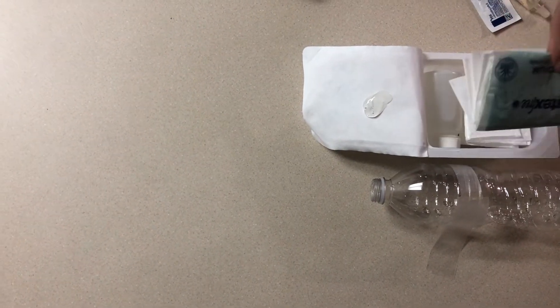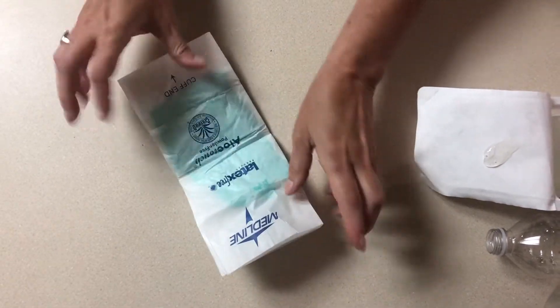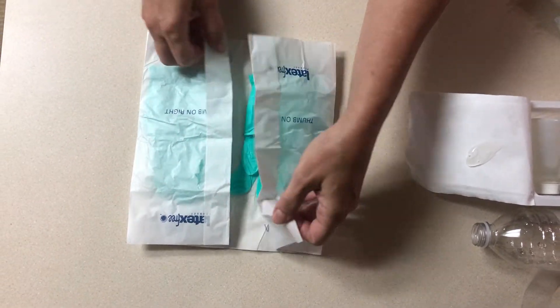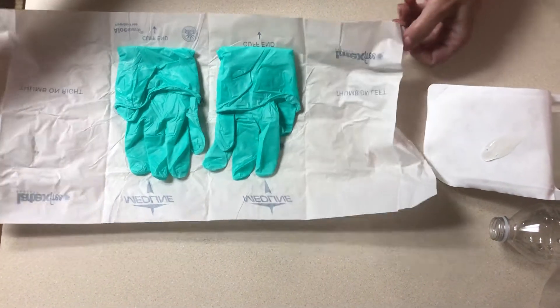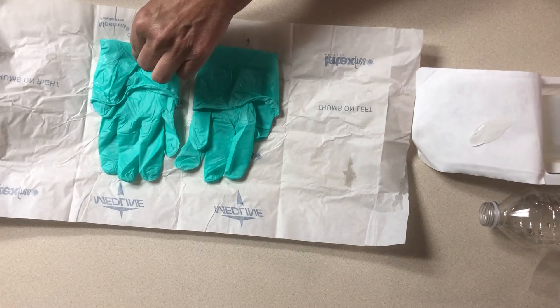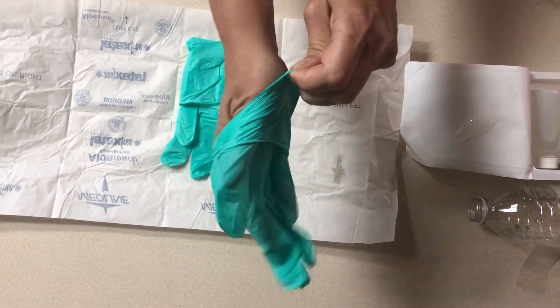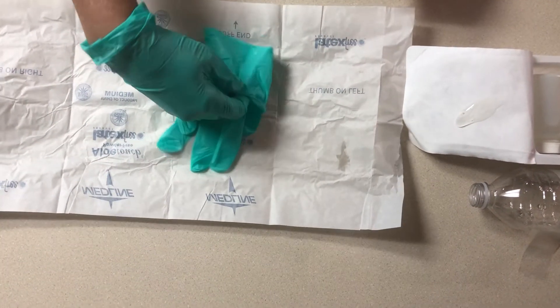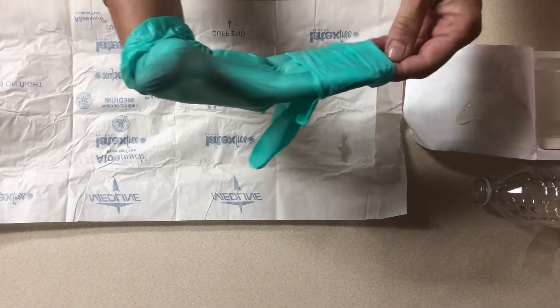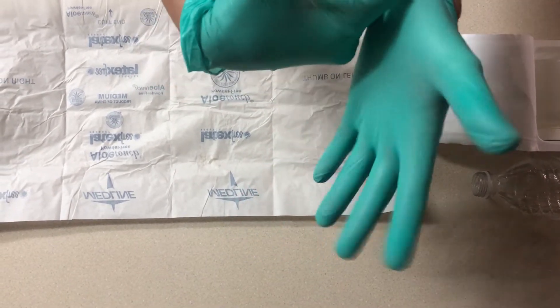Then carefully remove your sterile gloves and put them on.